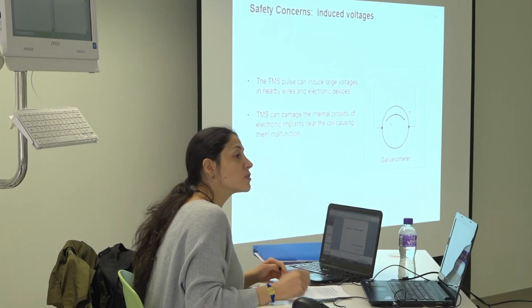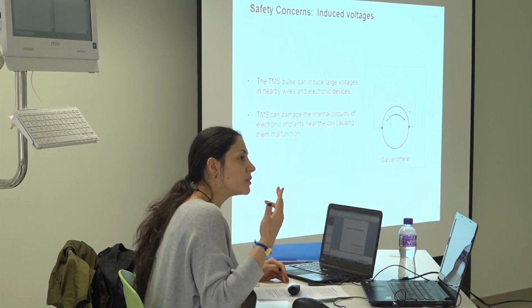TMS can damage the internal circuitry of electronic implants near the coil, causing malfunction. So anything that is implanted, you should really keep an eye on this, because TMS can damage it, okay?